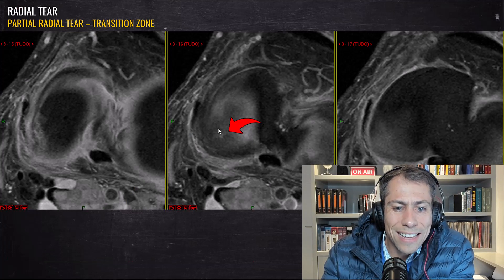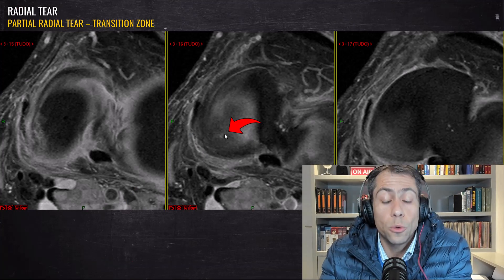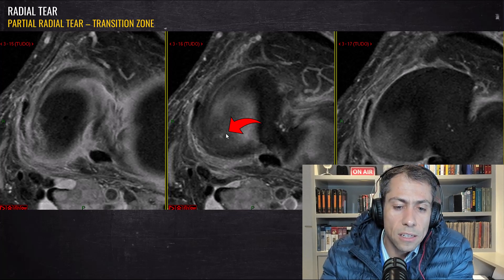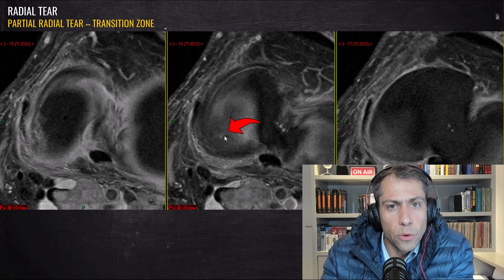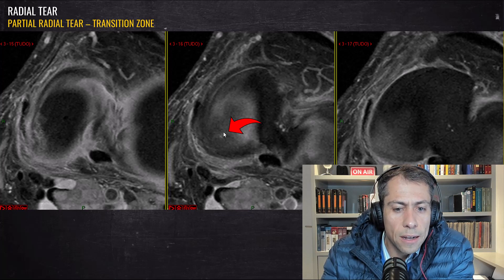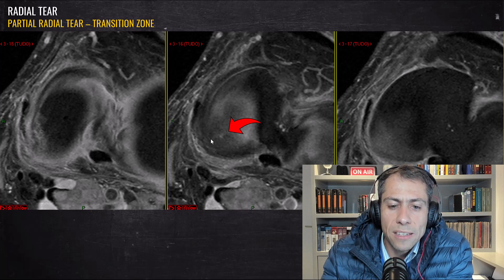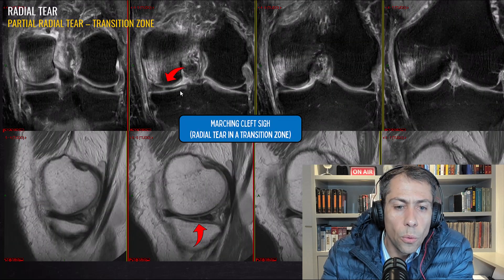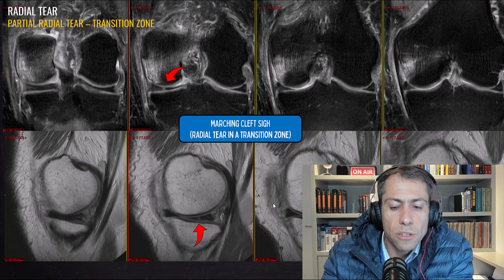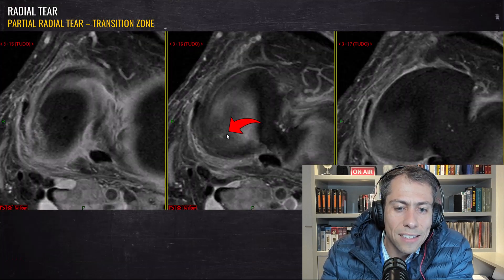In the sagittal plane, look at the axial plane — there is the tear in this region. Again, this is a 2D sequence; with 3D sequences it's much better to identify the tears. But by triangulating with the other images I'm confident that this is the area of the radial tear.